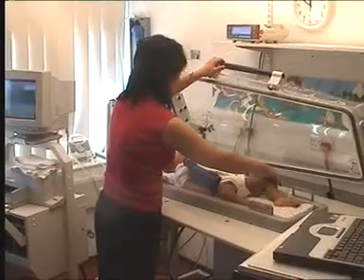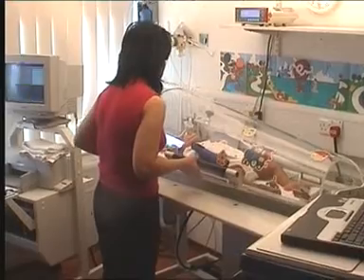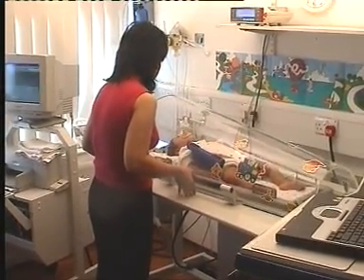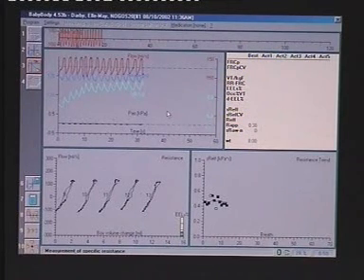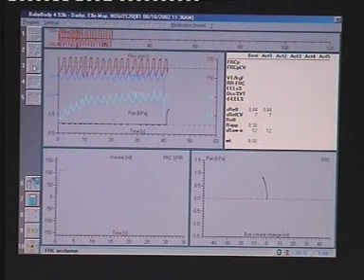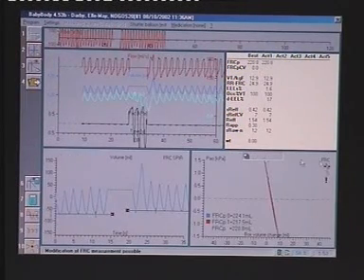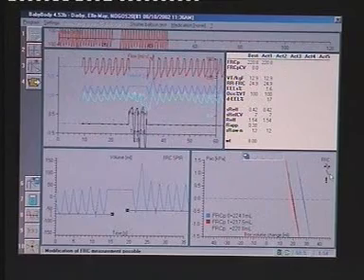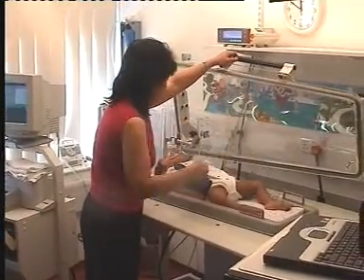Before closing the plethysmograph, ensure the infant's arms and legs are safely tucked out of the way, and that no bedding, tubing or wires get trapped beneath the seal. After closing, 2 to 3 minutes are required for thermal equilibrium to be achieved. Once the box signal has stabilized, measurements can proceed. Lung volume at functional residual capacity is measured by performing brief intermittent airway occlusions while the infant breathes quietly within the plethysmograph. These measurements usually take about 5 minutes, after which the box is opened so that forced expiratory manoeuvres can be performed.